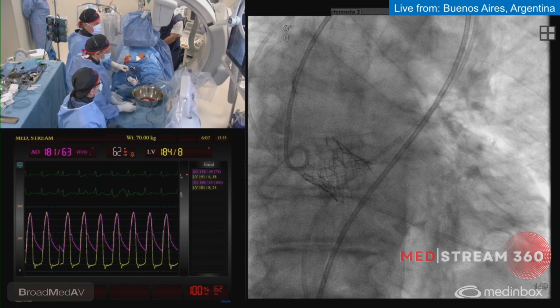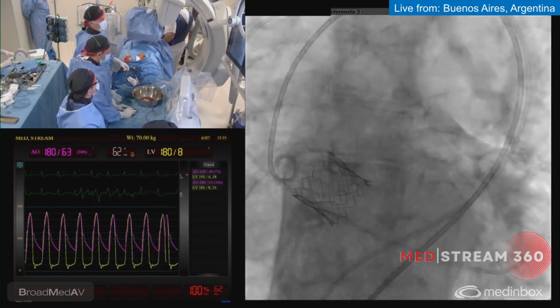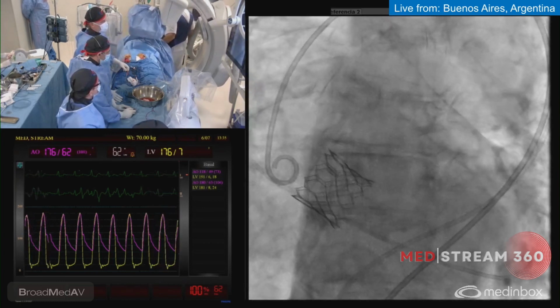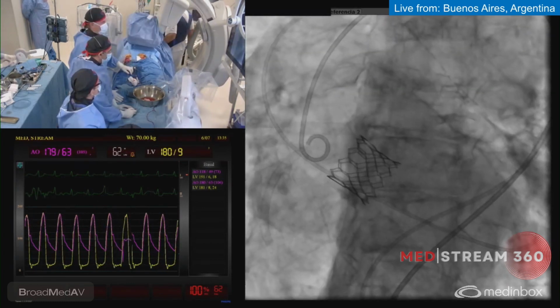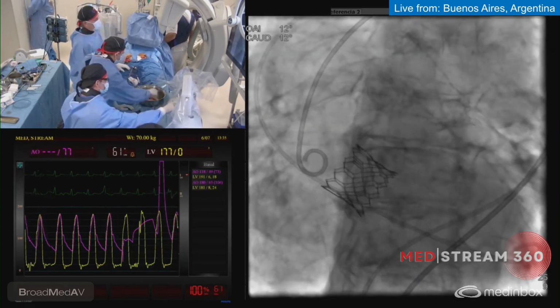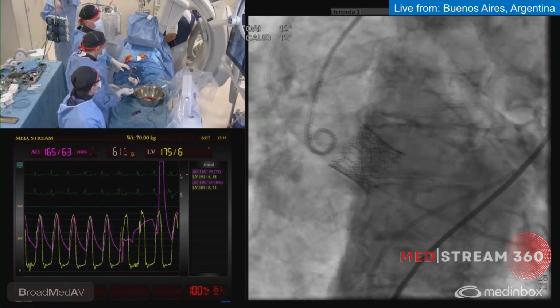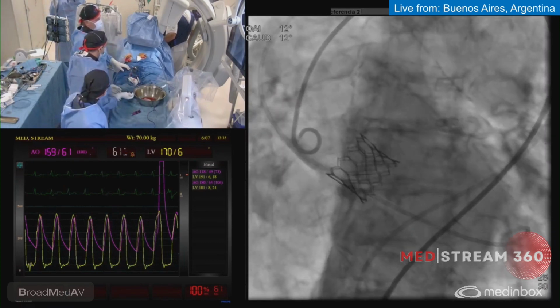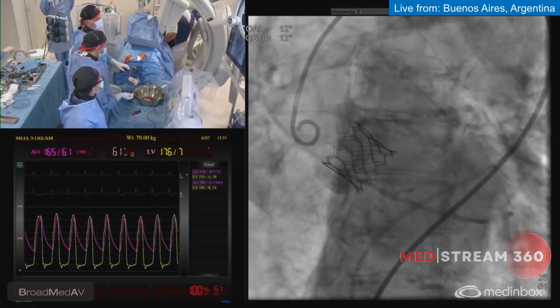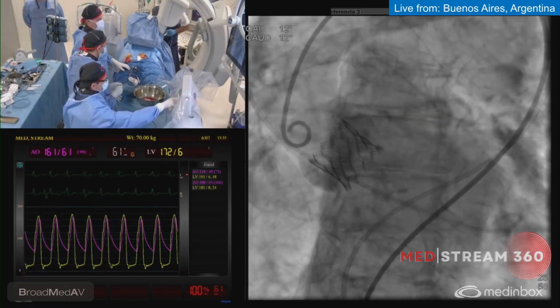And diastolic is okay, with a very nice notch or indentation. And here is a good position for the angio. I think the outcome is okay. I shouldn't go too high with the oversizing. Remember that we were about 10 with half a cc less with the 23.